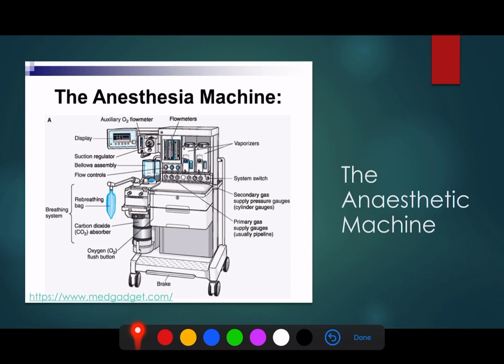For the intensive care patient, you may not have these vaporizers. It depends on whether we run out of things like propofol, in which case you might need these vaporizers to try and keep patients asleep and not waste as much of the propofol for other patients.